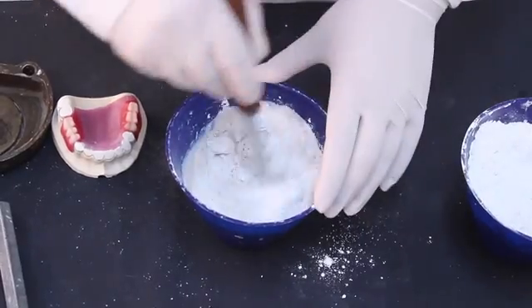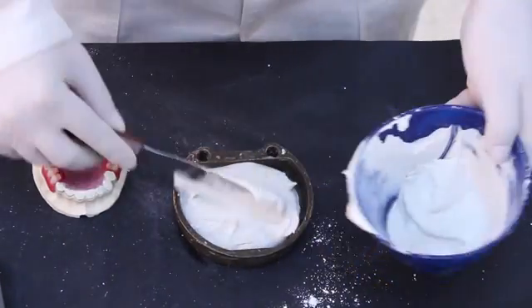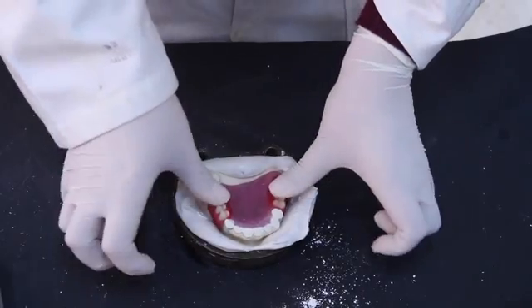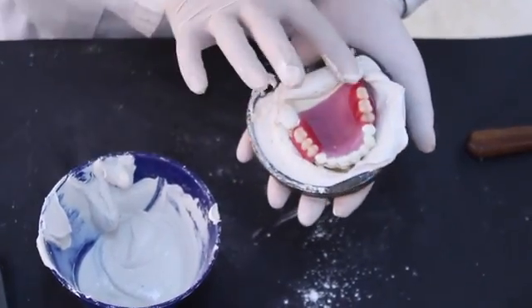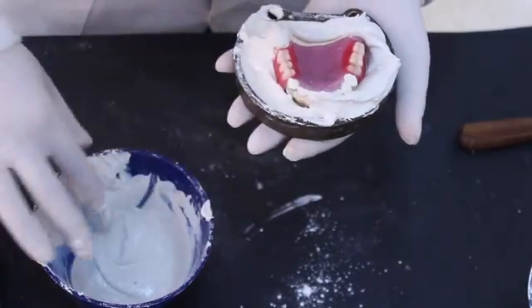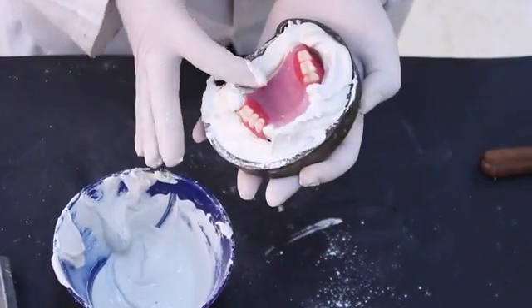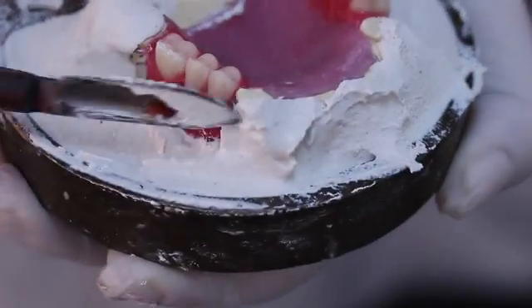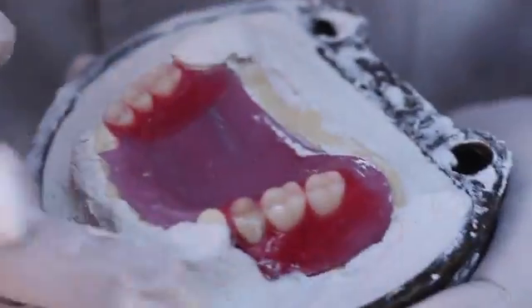A mix of type 2 dental stone is prepared and placed into the lower portion of the flask. The cast is then settled into the flask and depressed until the land area of the cast is even with or slightly below the rim of the flask. The investing stone should be even with the land area of the cast. When the stone begins to harden, it is trimmed and smoothed with a plaster knife under running tap water. Care must be taken to ensure that the surface of the investing stone does not exhibit any mechanical undercuts. Note that the abutment teeth should be totally covered with dental plaster and the wrought wire clasps should be embedded inside the dental stone.